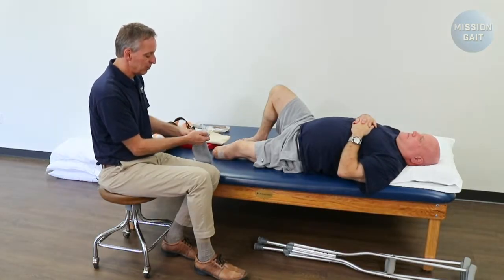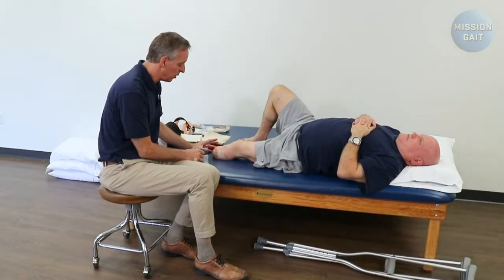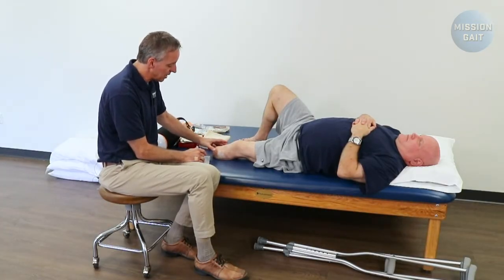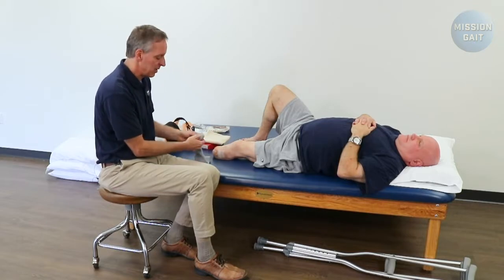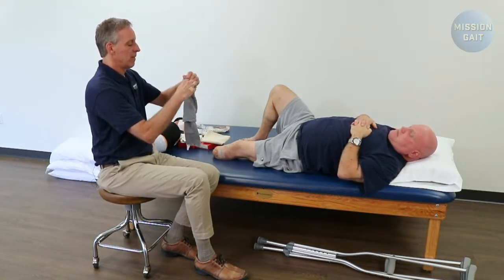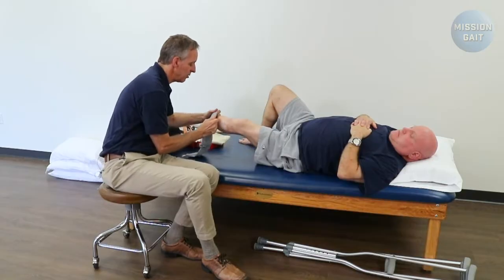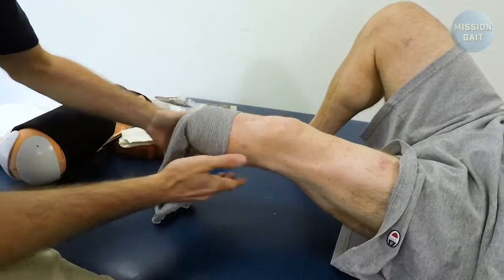With Compressy Grip, donning a Compressy Grip or any shrinker, it's very important that you don't drag it on. You don't pull it from the bottom and drag it up like a sock — that'll cause damage to the incision line, particularly on the sides and bottom, whether there's glue, sutures, staples, or tape. So you're always going to roll the shrinker back so you get more of the center, expand it much like putting on a stocking cap, and set it over the top of the end of the residual limb. Notice I'm not rubbing over the incision line.